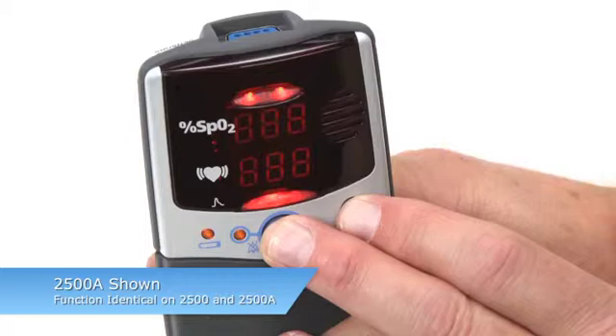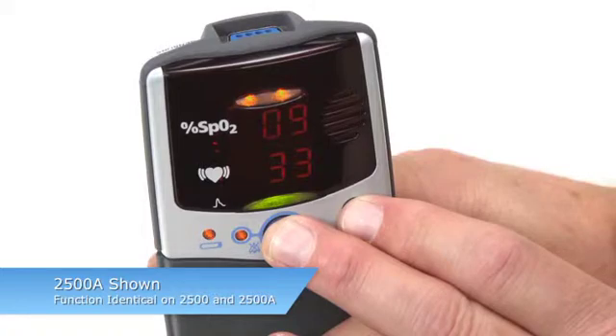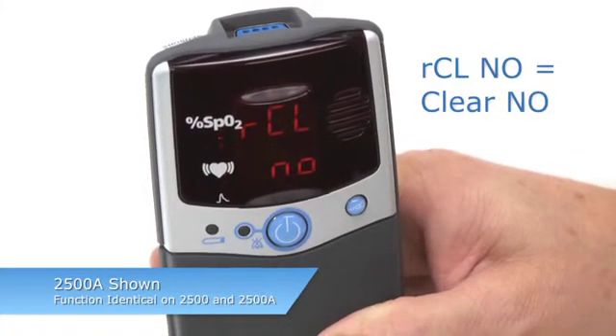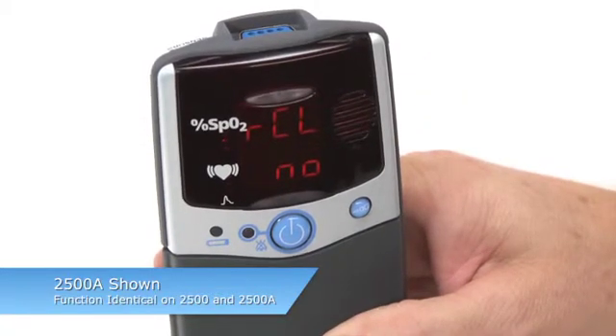A series of three 8s will appear in the Pulse Rate and SpO2 areas, and the clock time will briefly appear, followed by RCL, NO. This allows you to retain the memory on the oximeter or clear it.